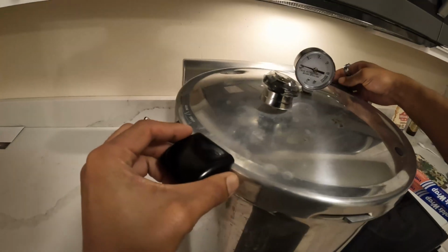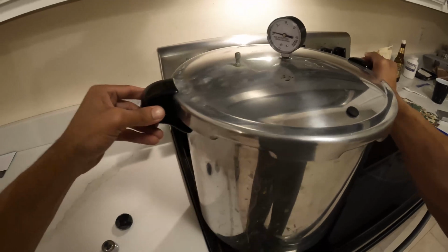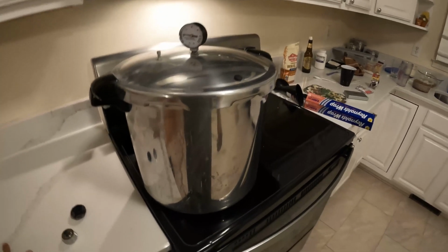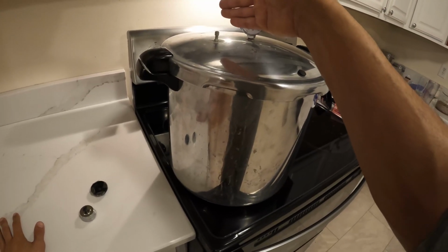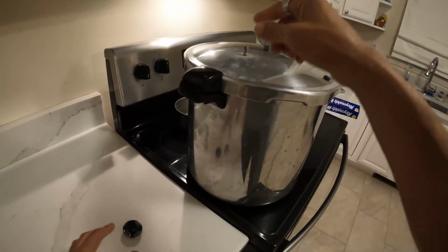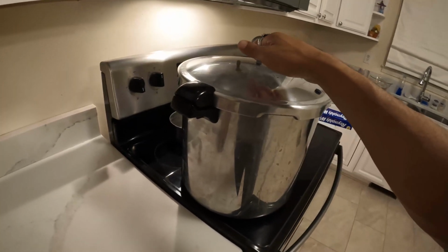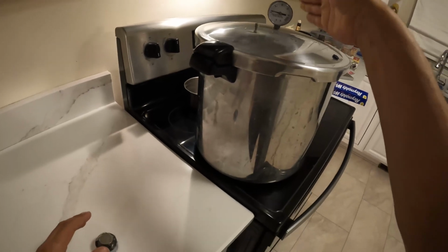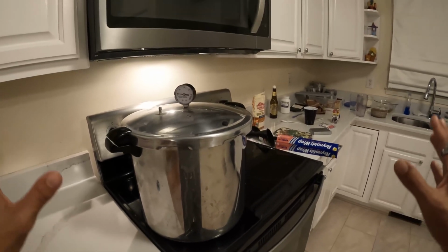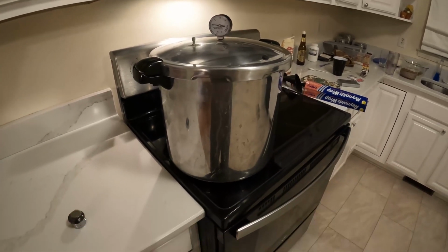See how it lines up to a certain spot. What'll happen is, here in a moment, this is going to start steaming out hot air. It's going to steam out hot air for 10 minutes. Once you can actually visibly see it, start the timer for 10 minutes. Once you've done that for 10 minutes, you'll put the cap on like such, and then the pressure will start to rise. Once the pressure gets to 15 psi, that's when your actual timer starts. None of the timer has started yet. You'll pressure cook this for 25 to 30 minutes, and then it's done.